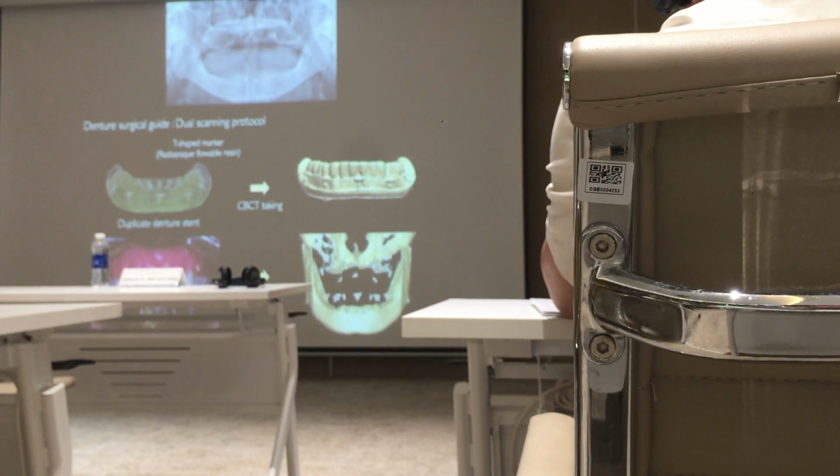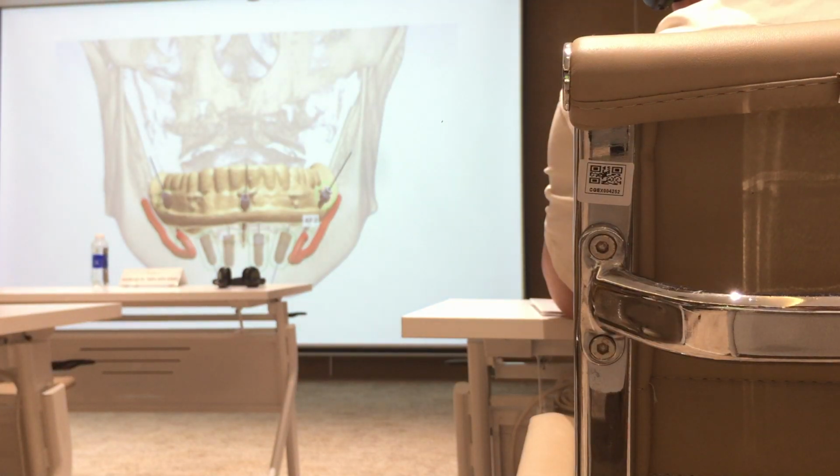And the second scan is we put the radiographic stent in the patient's mouth and we take CBCT. And because this T marker is radiopaque, we can see it from the CT. So because we have these two CT data, we can merge these two with the reference point T marker. So in the software, we planned our implants, 4 implants, and all-on-4 concept.